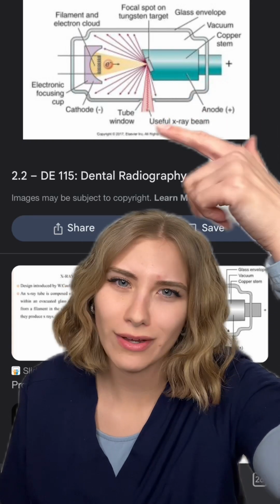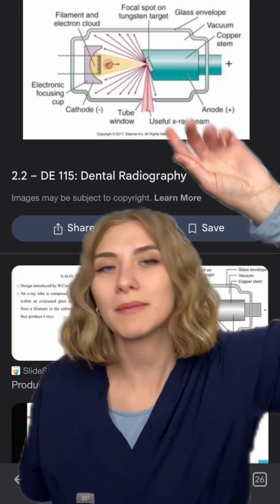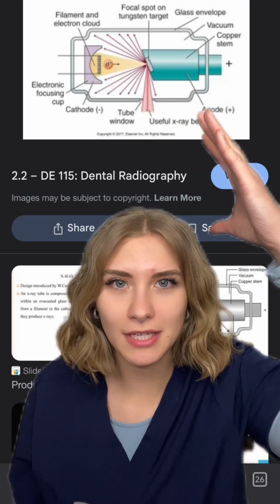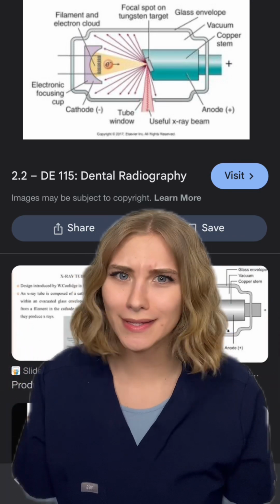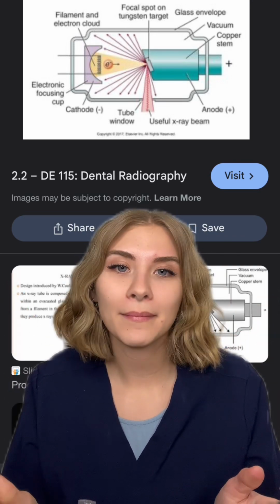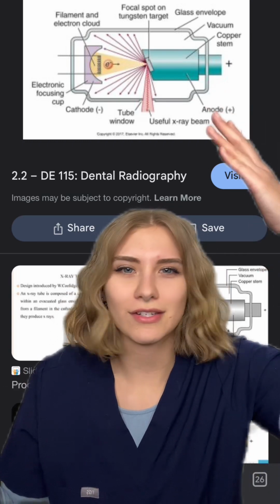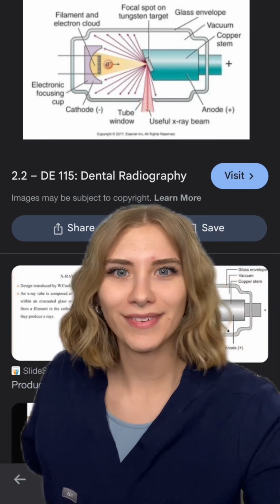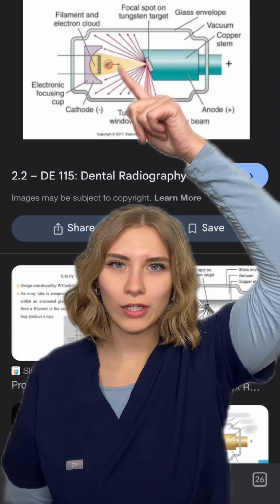or the tube window. So the anode has the tungsten target, like I said, but it's also made of copper. So the tungsten target stops the electron so that energy can be converted into X-rays, and the copper stem basically dissipates the heat away from the tungsten target. Science.